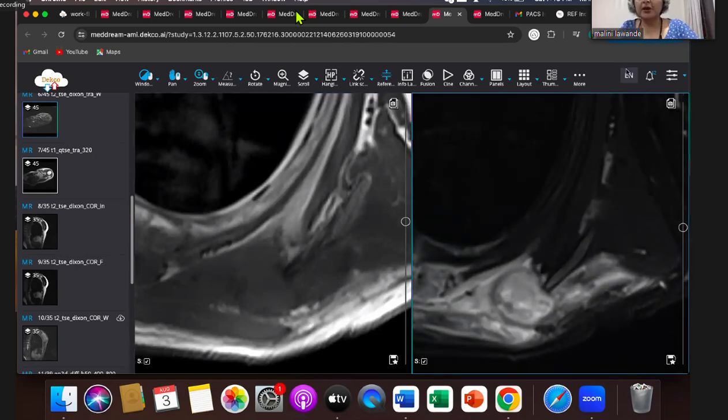Okay, so let's look at the choices everyone's coming up with. Tuberculosis, elastofibroma, soft tissue sarcoma, tubercular, infective. So most of the people are leaning towards infective. Some thought of soft tissue sarcoma, and some are thinking of Ewing's, basically sarcomas, tuberculous, and elastofibroma dorsi. These are the three thoughts that everyone's answered till now.